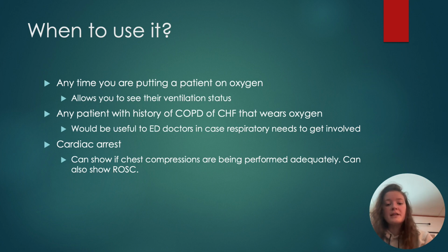In case respiratory needs to get involved, it is something when you give a report, you can give the doc, like, hey, I have a patient, history of CHF, wears 2 liters of oxygen at home, they're needing 3, their end tidal is 50, 55. It'd be useful for them to know, to realize that they are still holding on to that CO2.